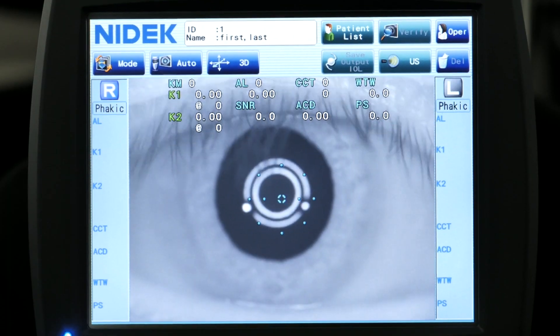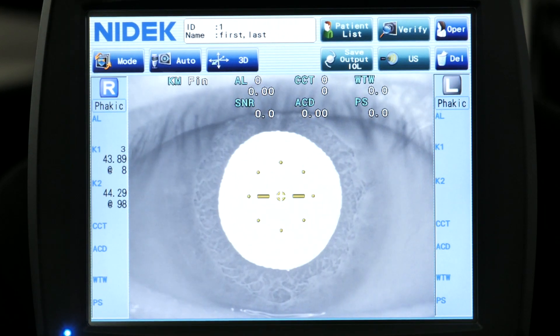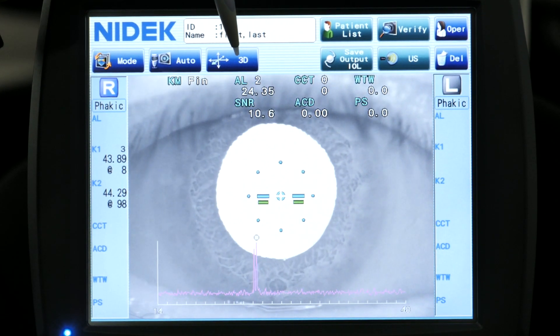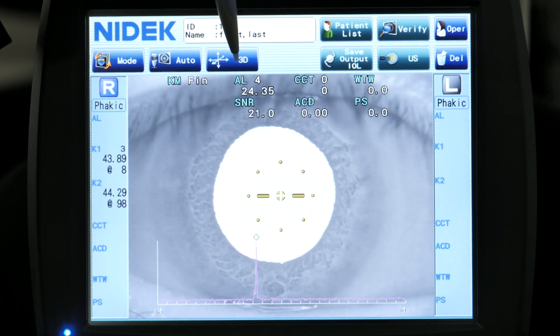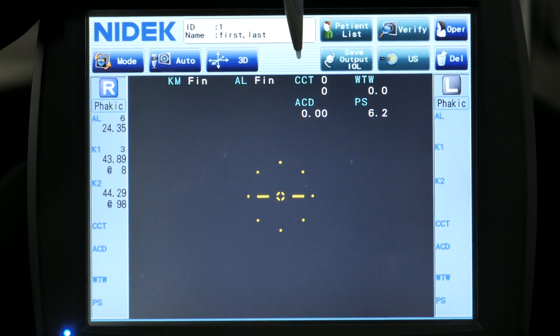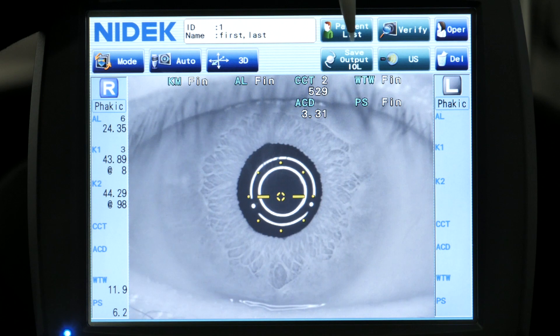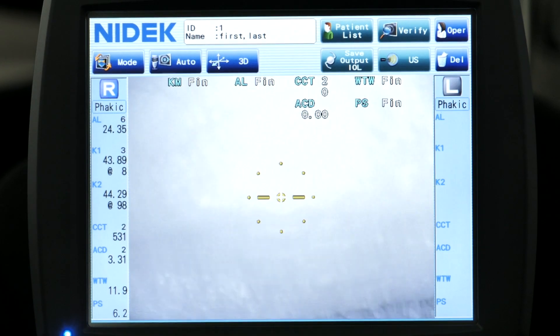So you just essentially align this up to the patient's pupil, move the device in, it takes over. It's given us the K measurements already, it's given us our axial length measurements, then it's going to move over and get you central corneal thickness, anterior chamber depth, white to white, and pupil size.